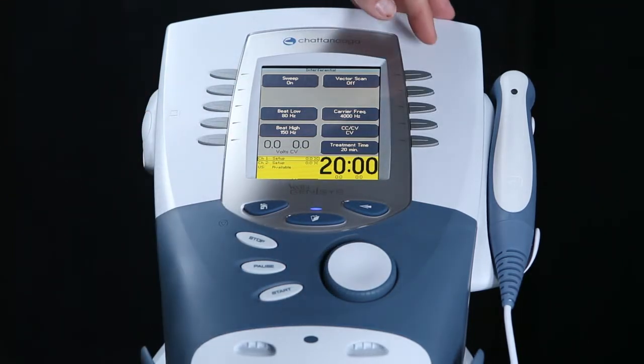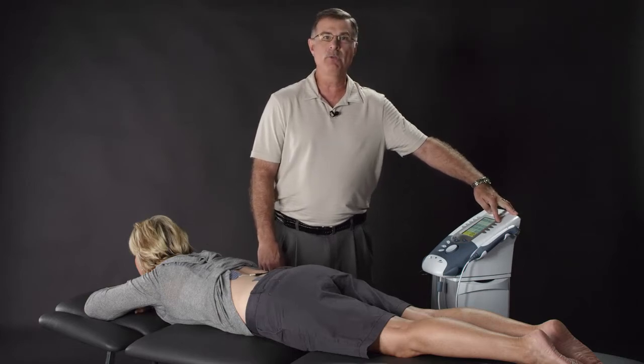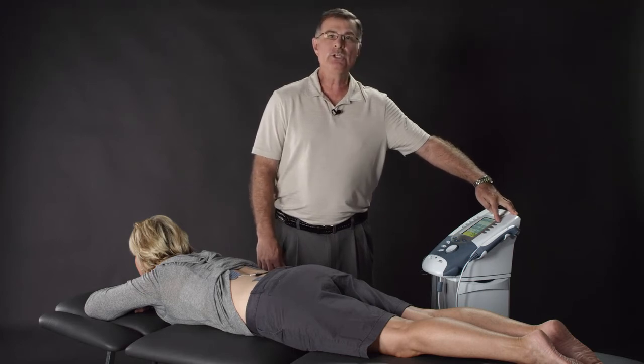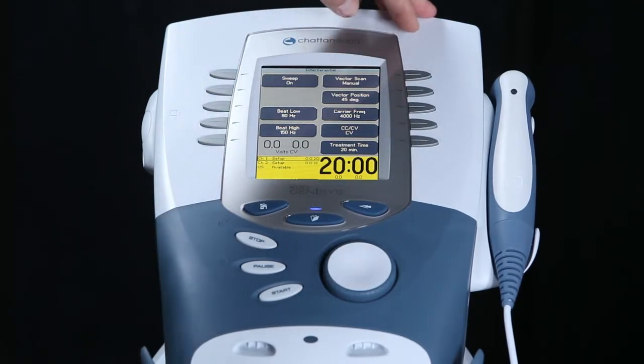The next adjustable parameter then is the vector scan. Where the two channels cross, they create an interference wave. They will cross at the point of least resistance. If the vector scan is off, the patient will feel that at one particular area. If we want to change the patient feel, we have the ability to change the vector scan to manual, and we can then adjust the output of the two channels so that we can actually change the field or change where the therapeutic area is.